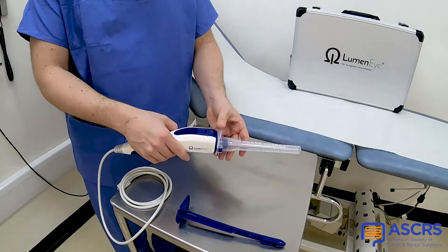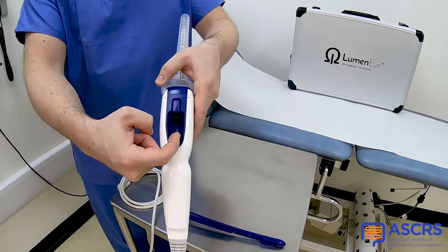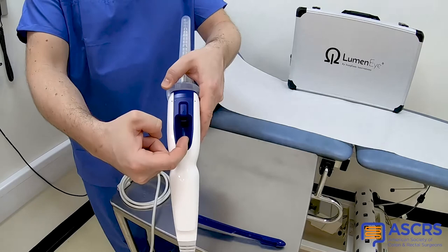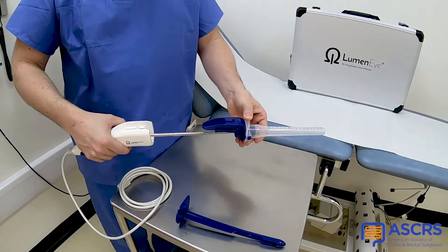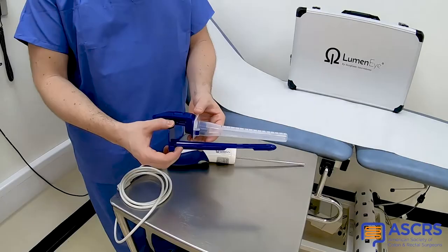The manifold contains a 3mm biopsy port through which forceps and snares can be passed. At the end of the procedure, the handpiece is removed from the manifold sleeve assembly and cleaned using the Tristel-Trial wipe system. The manifold sleeve assembly and introducer are both disposed of in the clinical waste.